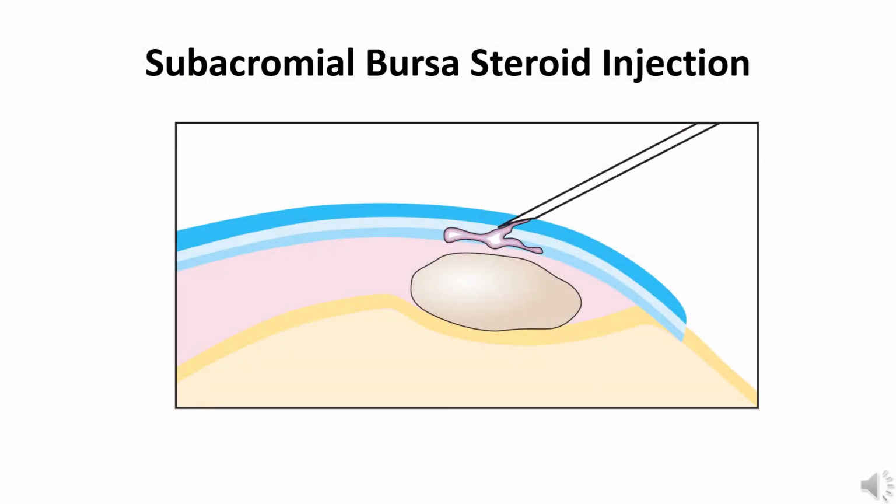At the end of fenestration and lavage, the subacromial bursa is injected with corticosteroids. From the trauma induced from fenestration, the patient will experience a very painful inflammatory response, and the steroid minimizes this response. I have found that most of my patients seldom have severe pain after the procedure, and I attribute this largely to the corticosteroid injection.